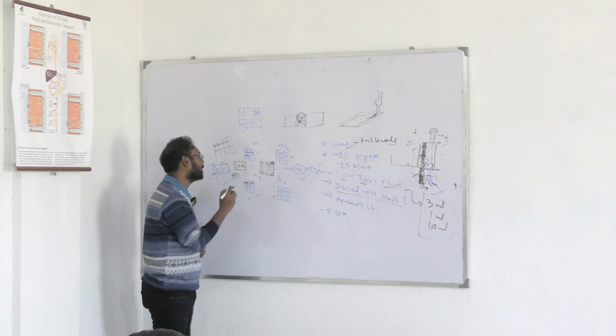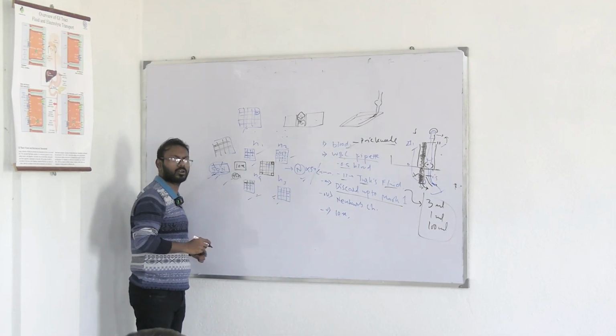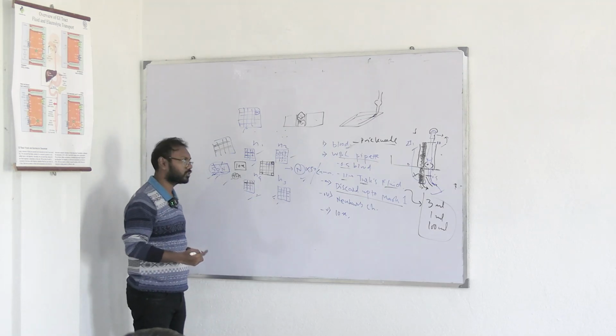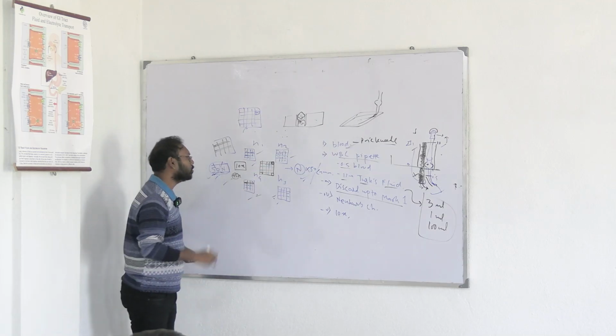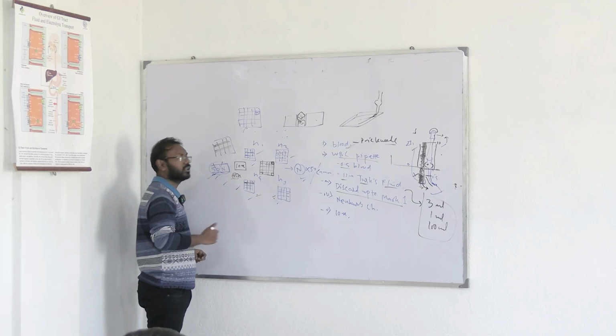So even if you by mistake put it at 45x, these lines will make you aware that this should not be like this, there should be a single line here. So then check your power. You will surely see that you have increased it. If you don't increase the power, this small cell will never look as big as this. So if by chance you make a mistake, you can rectify it here.